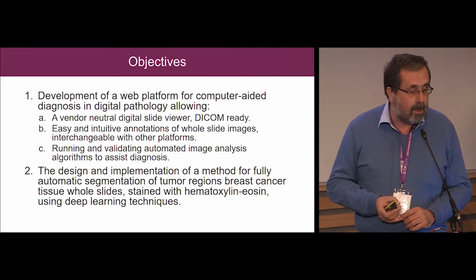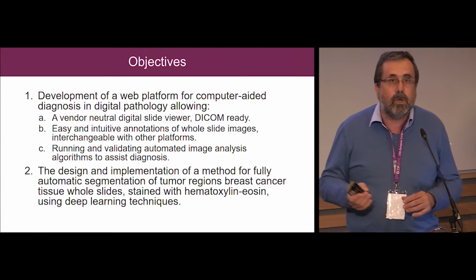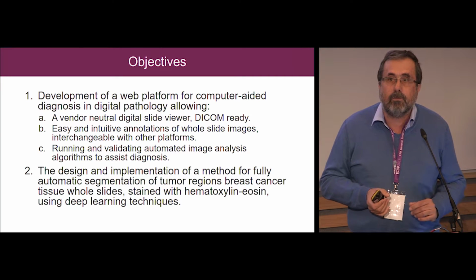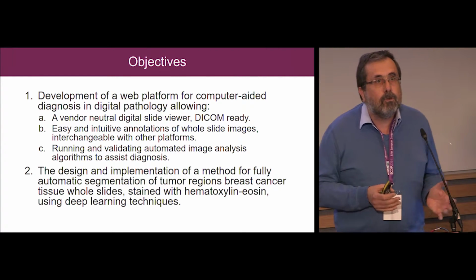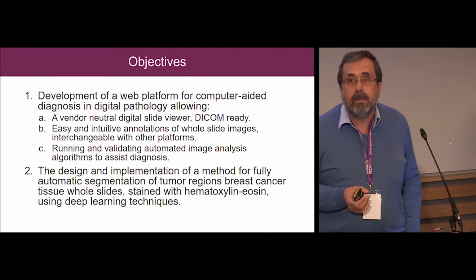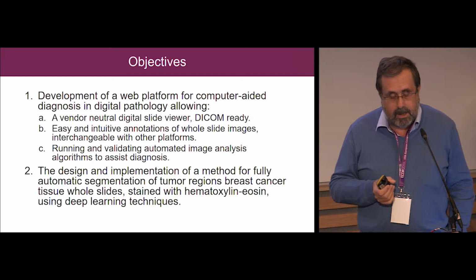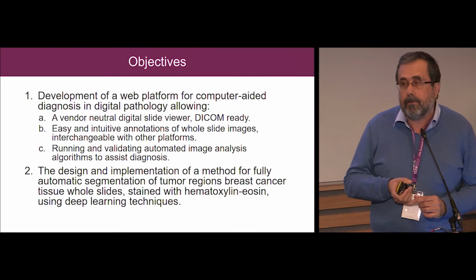First, we developed a web platform aimed at this collaboration between the 5 hospitals, and then we realized that some of us had a 3D HISTECH scanner, and one other hospital had a Roche DP200 scanner.